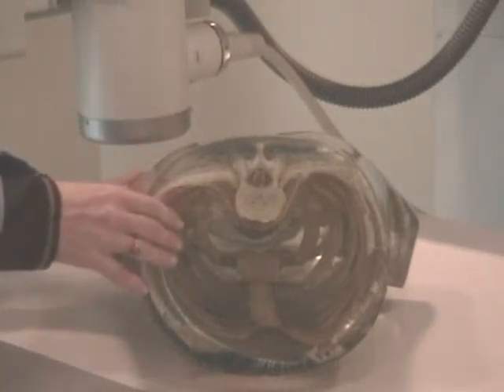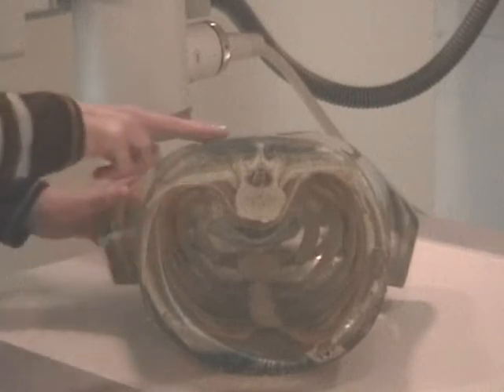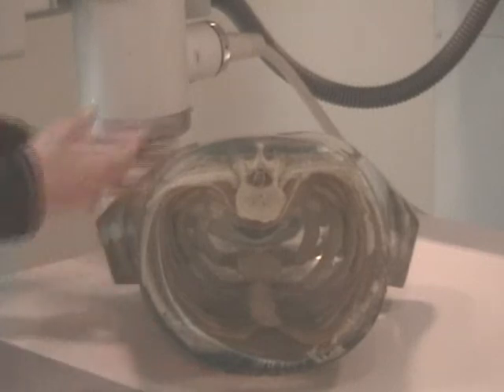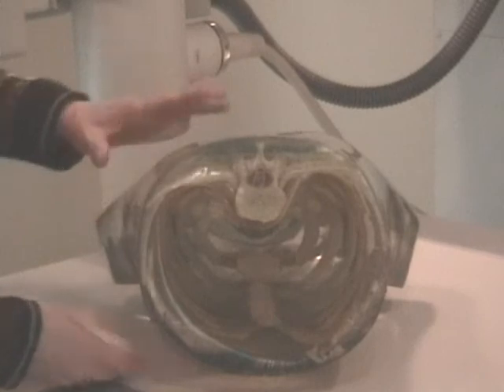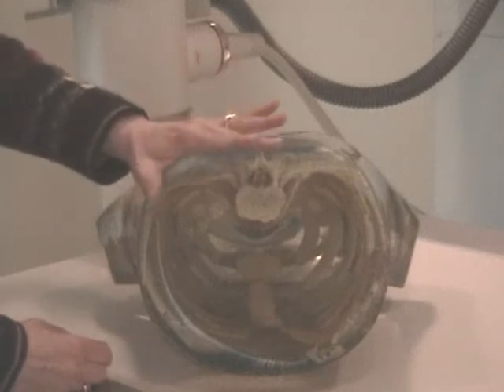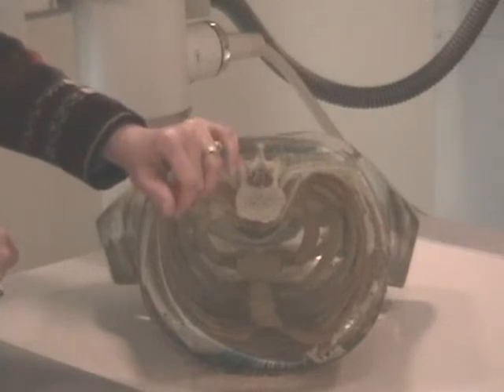Some techs will actually turn the patient over to do the small film in an AP position because of the shortness of the lower ribs. They don't come around to the front, and the reason you do it PA is to get the injury side closest to the film, but the 11th and 12th ribs actually don't come around the front, so they do their 10 by 12 in an AP position. And I'll try to clarify that again in a minute because that tends to be confusing.